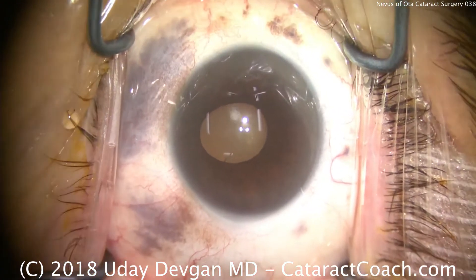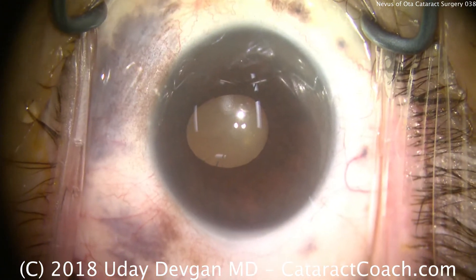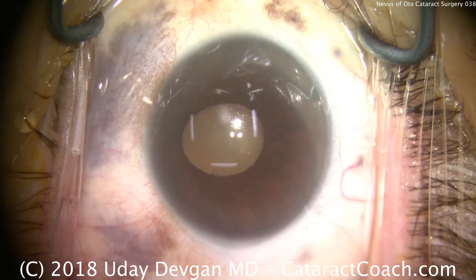This patient has the nevus of Ota — skin pigmentation changes, as well as hyperpigmented lesions on the sclera.